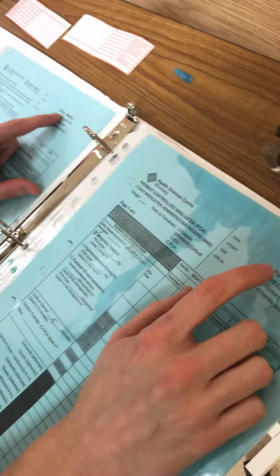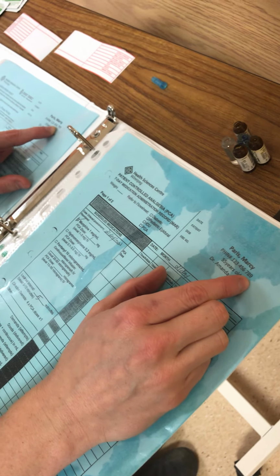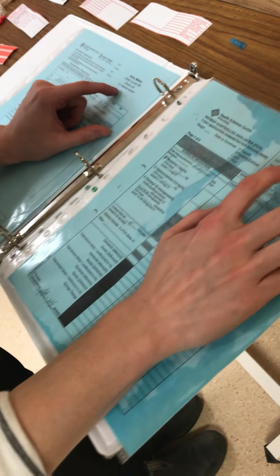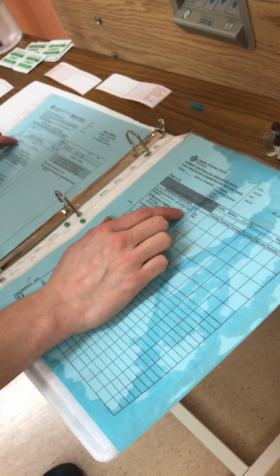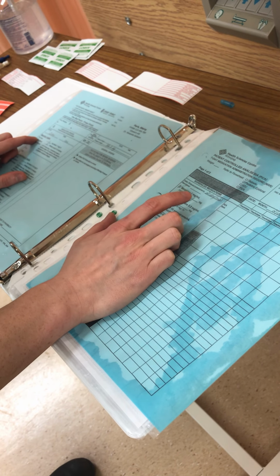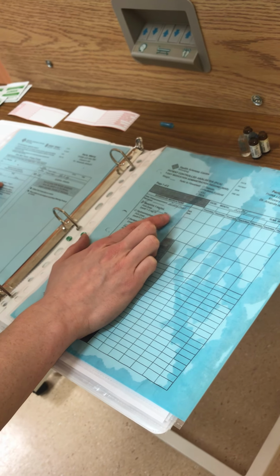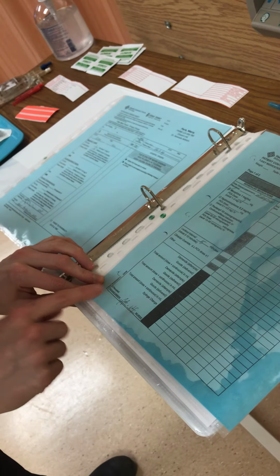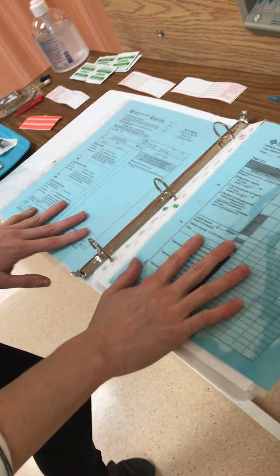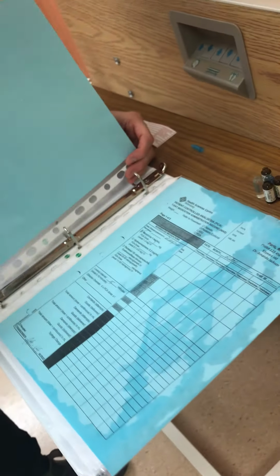The patient MAR is right here. Looking at the patient MAR, I've got Paris Marcy, FIN 123456789, 55 years old, Dr. Amanda Jackson. So I'm looking at the date, and the time is now. The PCA dose is 1 milligram of morphine at 1 milligram per milliliter with a lockout time of 5 minutes. And I see that there are 2 signatures. So I feel good about this MAR, and I can put the doctor's orders away now.